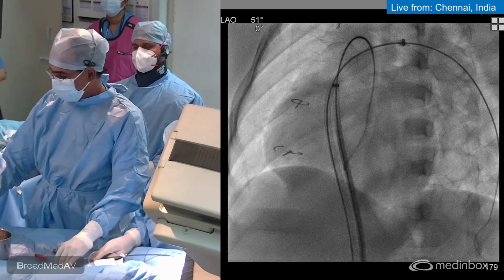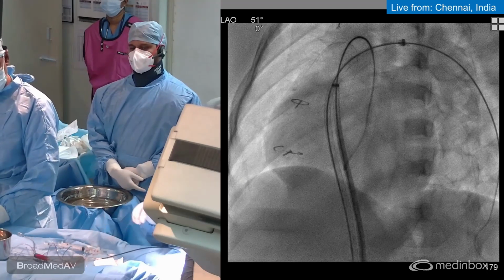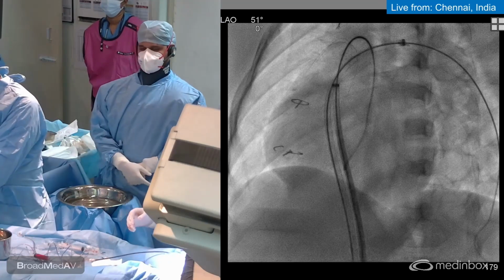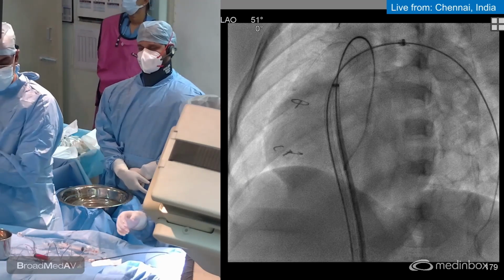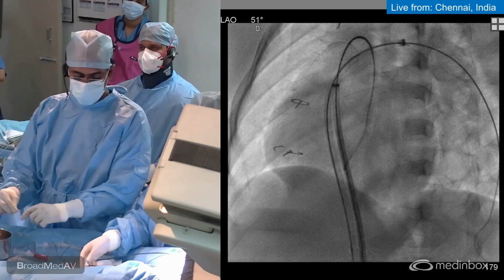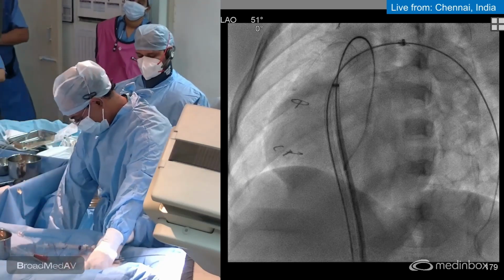Contrary to many other interventions that we were doing, for this MedStream, today this is a total pediatric intervention, which is in a small child, and this problem is going to be faced predominantly by the pediatric cardiologists across the world.